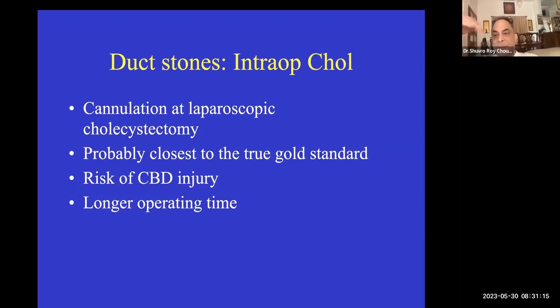I was talking about Spyglass from the percutaneous end, because I had a very difficult biliary stricture which looked malignant, but we have tried biopsying it three times. I've done endobiliary biopsy, I've done endobiliary brush, we have done percutaneous biopsy, everything is negative. This is the difficult situation you sometimes have with biliary strictures, trying to prove whether benign or malignant. CA 19-9 is 4,900, but we can't prove malignancy. Yes, we can go through the percutaneous route also to do Spyglass.